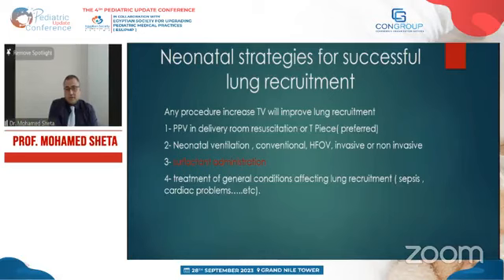The lung function will improve with surfactant in spite of decreasing the pressure, PEEP, FiO2 and the other parameters gradually after surfactant administration. This means that this lung has improving recruitment and improving function after surfactant administration.